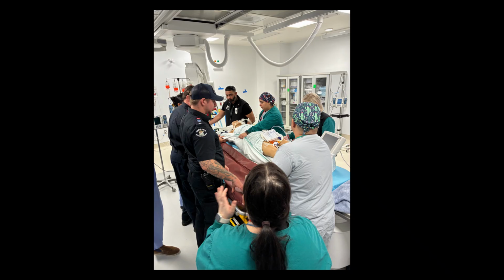This should include verifying the roles and responsibilities of each team member, ensuring all tubes and lines are being monitored, determining who will do the count prior to moving, i.e., 1, 2, 3, move. This will typically be the RT or the interventional cardiologist as they have the most invasive lines to monitor. As well, they need to confirm the cardiac arrest plan with the interventional cardiologist.